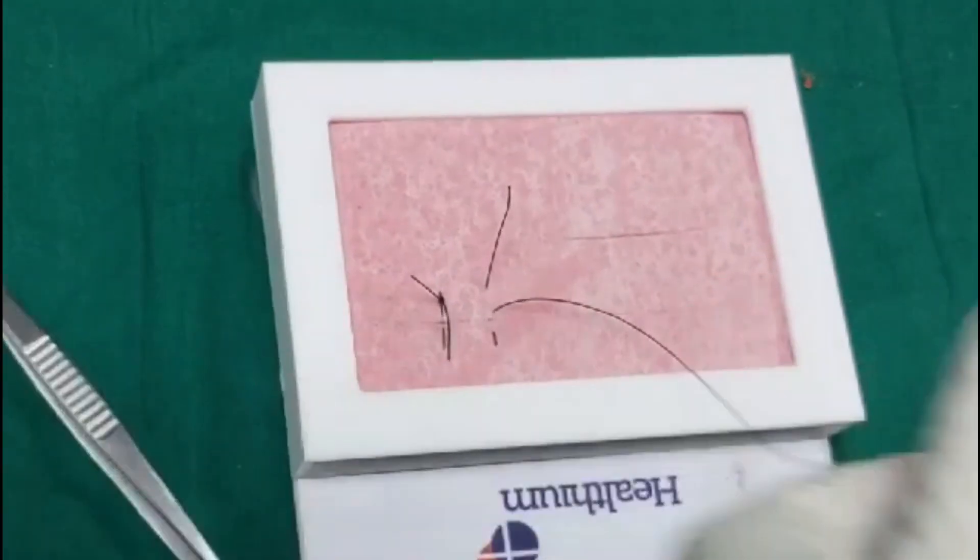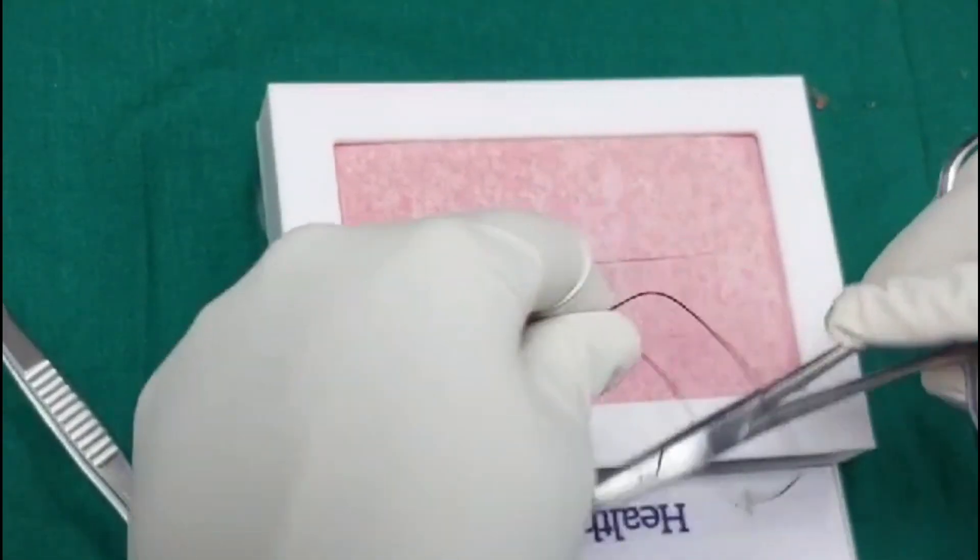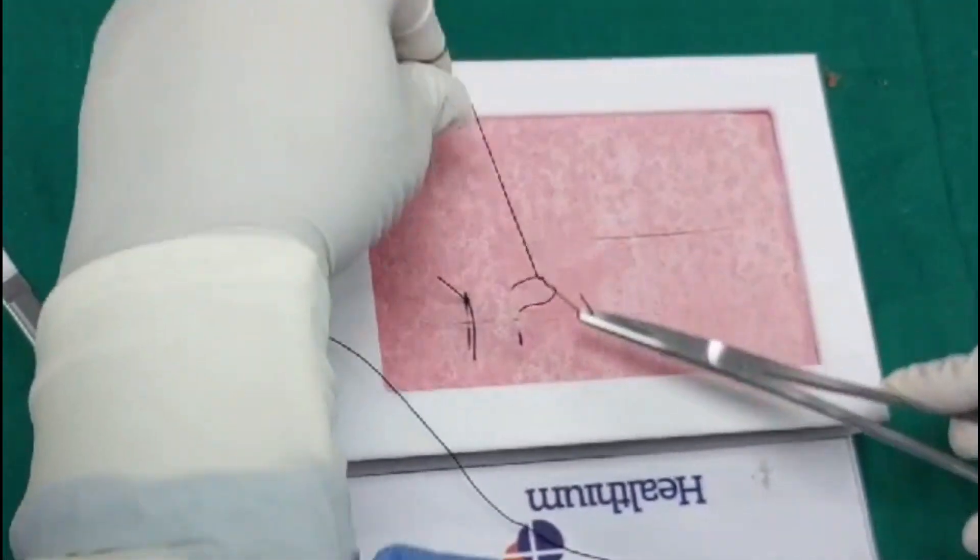Followed by knotting using instrumental tie, square knot or surgeon's knot.